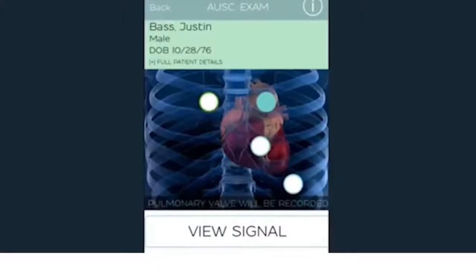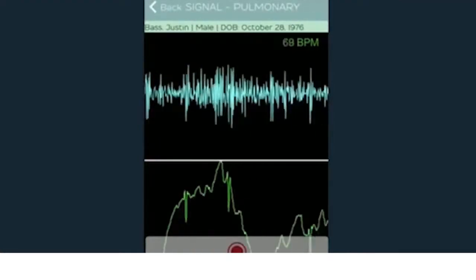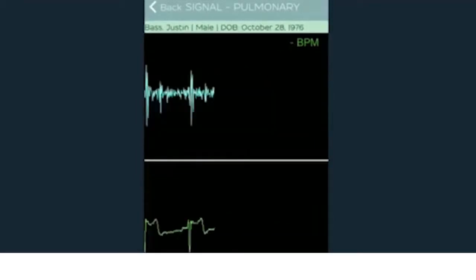Upon pressing the view signal, a digital heart sound signal and synchronized ECG are displayed. When a satisfactory signal has been acquired, the record button is pressed.